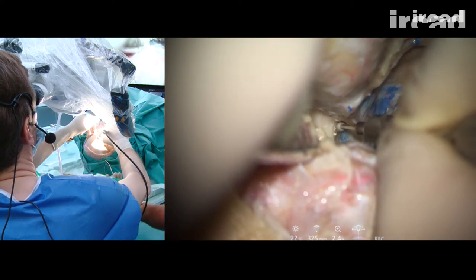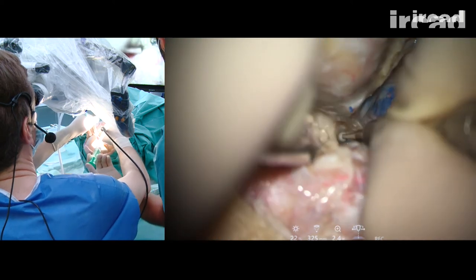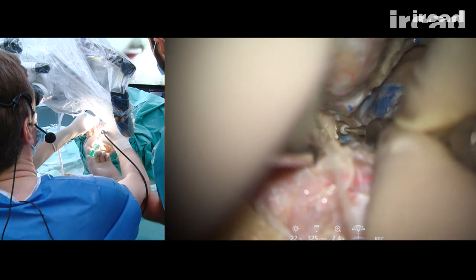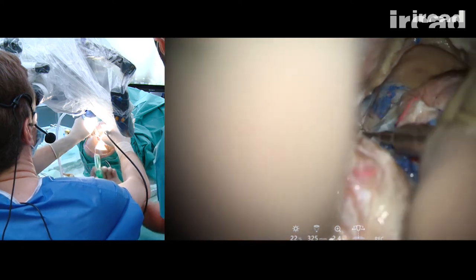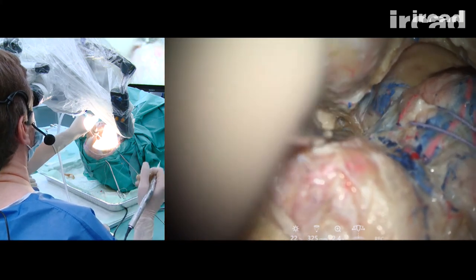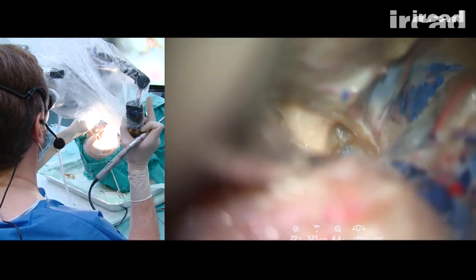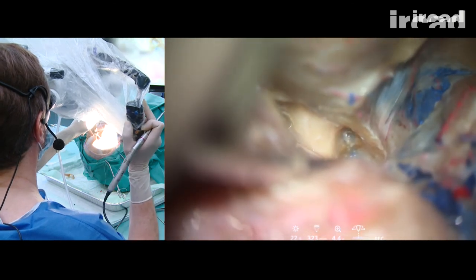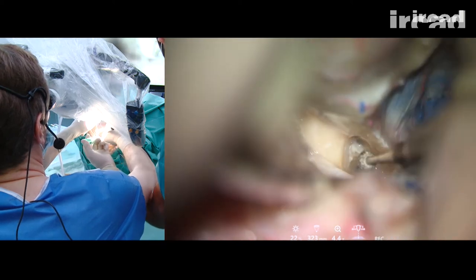Here is the optic strut, which is the inferior root of the clinoid process. I see the venous plexuses deep that are probably around the carotid artery. And I have the feeling that this is a pneumatization of the optic strut here. I have the feeling that this is mucosa of the sphenoid sinus, which is nice to see here. It means that there is a significant optico-carotid recess if we go endonasal. So this is mucosa.